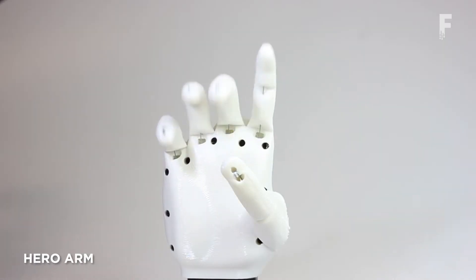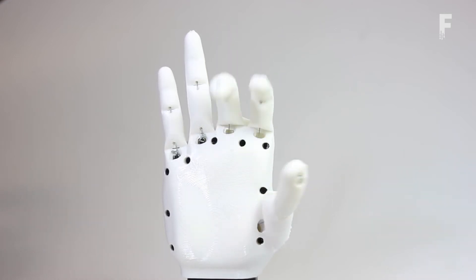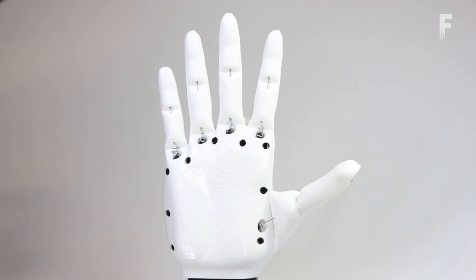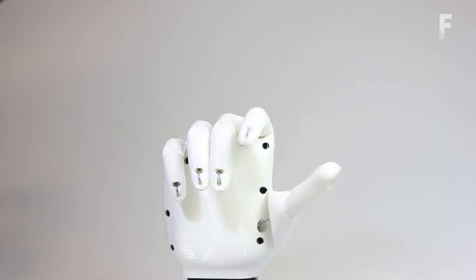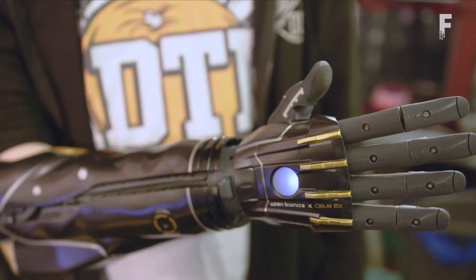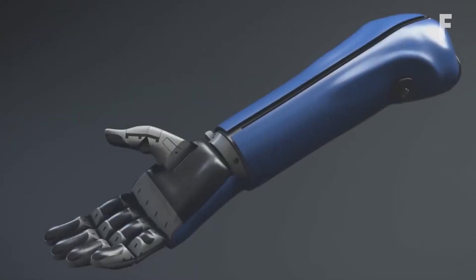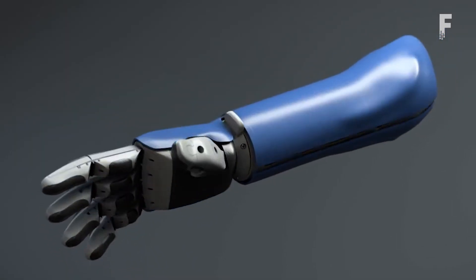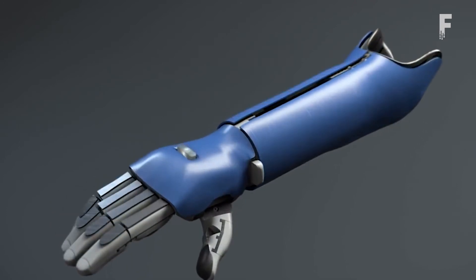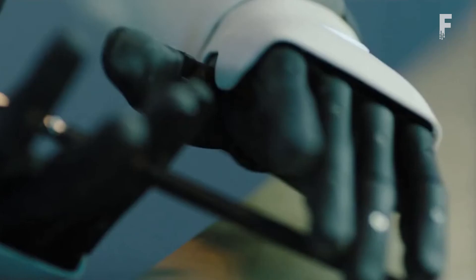The Hero Arm is an affordable, advanced, and intuitive bionic arm using medically approved 3D printed materials. Each one is custom built using 3D scanning and printing techniques, making it the world's first such prosthesis to be medically certified. A series of sensors allow the user to control the hand with ease, and haptic vibrations, beeps, buttons, and lights provide intuitive insight into its operation.